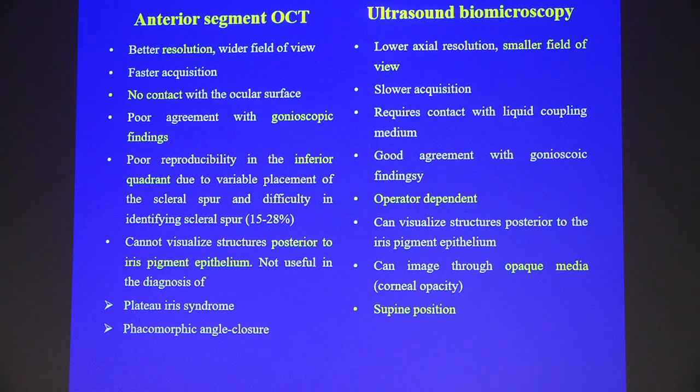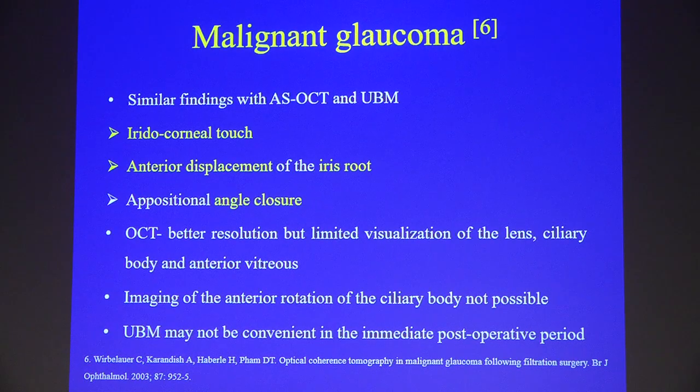So again, the anterior segment OCT versus the ultrasound biomicroscopy. I don't think I'll go into this because you have heard all this from the previous speakers. I'll come straight to malignant glaucoma.